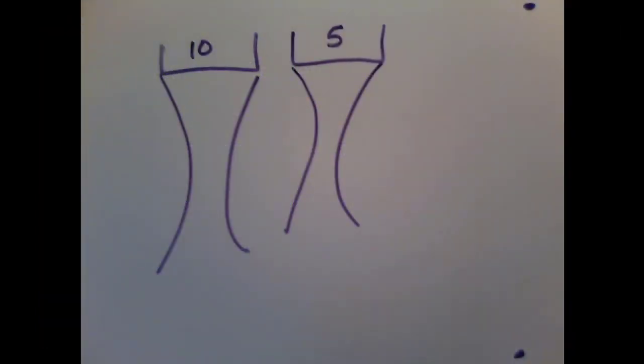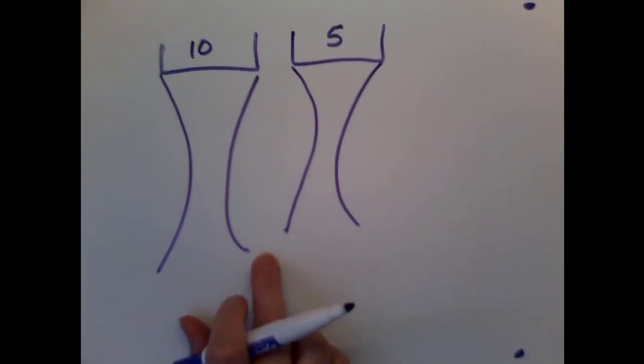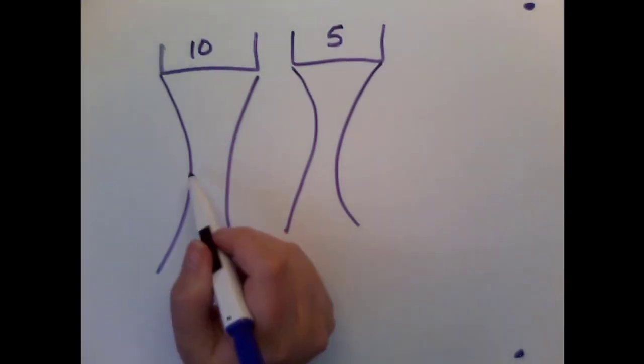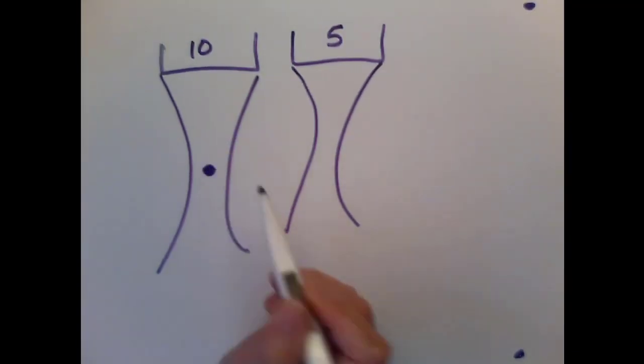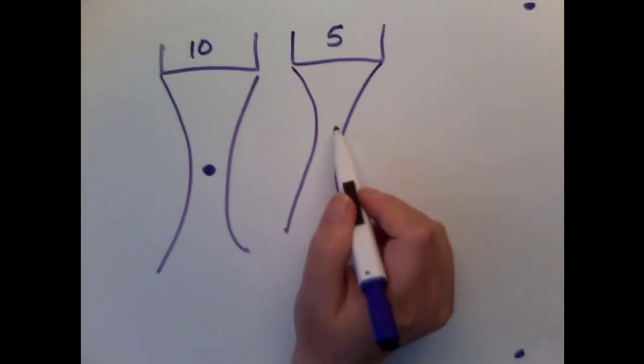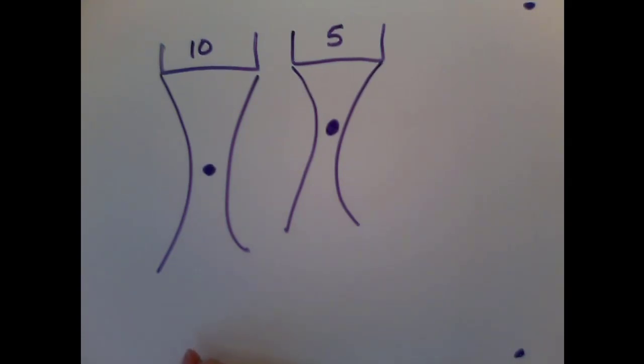So we're back to our transducers. They have equal diameters. The one on the left here is a 10 megahertz transducer, where the one on the right is a 5 megahertz transducer. We can see then when we increase our frequency, our depth becomes deeper. When we decrease the frequency, the depth decreases or becomes more shallow.